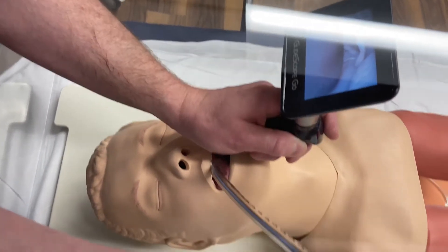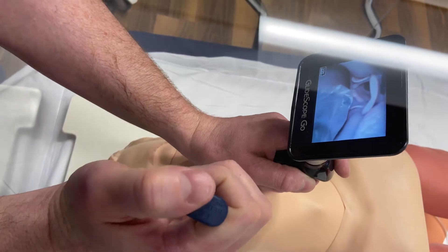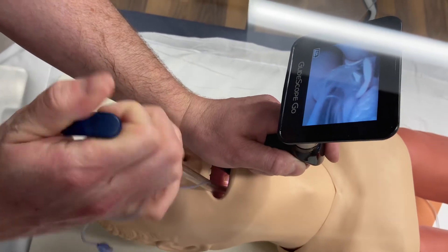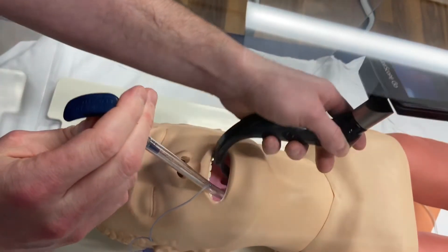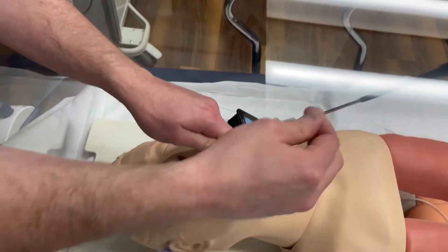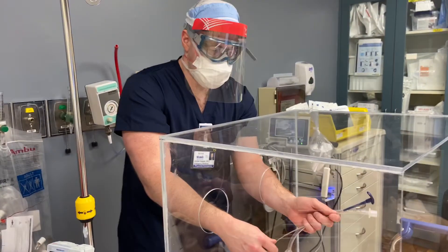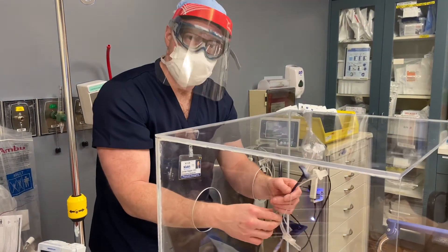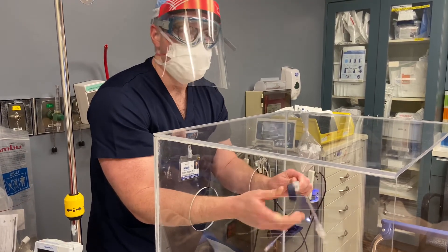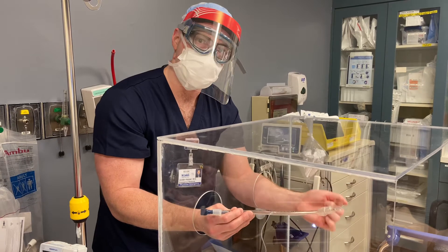Forget the cords, forget intubation, and just focus on getting that tube properly in. Sometimes you'll kind of hug the side of the GlideScope blade as you go in. You're holding your thumb on that joystick and maneuvering in — boom, you get your good view and then you pop the stylet. The last part is that you pull anteriorly with that stylet.